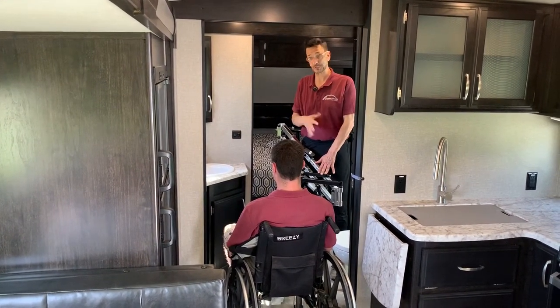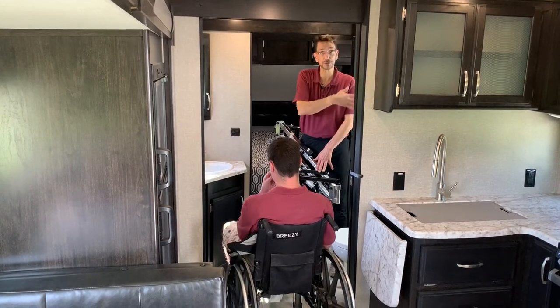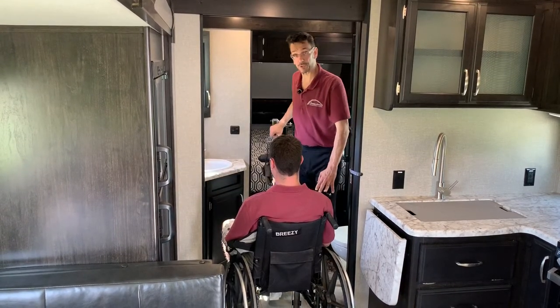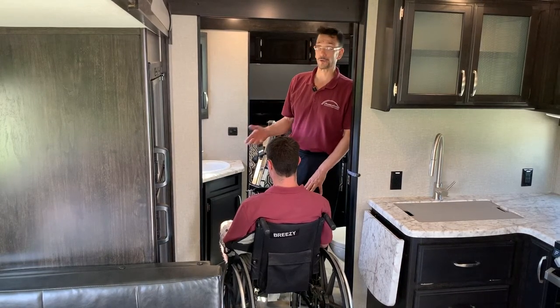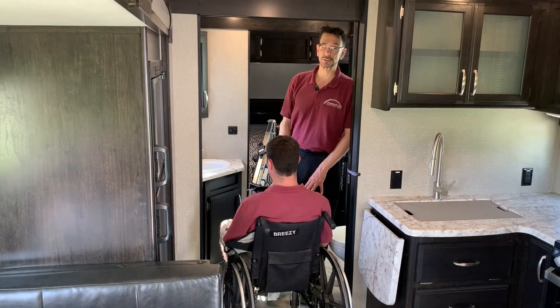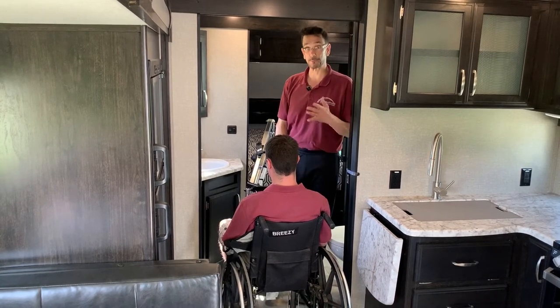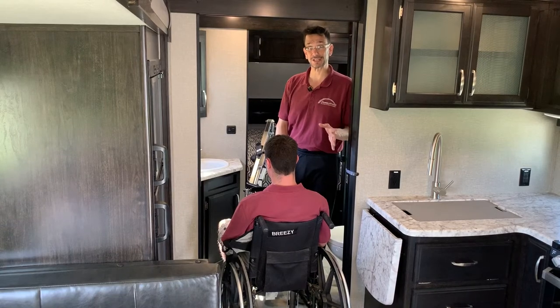This lift can also be used in the bedroom, bathroom, toilet, and shower — all these different types of transfers. You can also use the same lift to lift a person into and out of the vehicle that towed it, or a pickup truck, RV, SUV, different types of 4x4s, side-by-sides, your bathroom in your home, or your bedroom in your home with a portable base called the Easy Base. The possibilities are nearly endless.